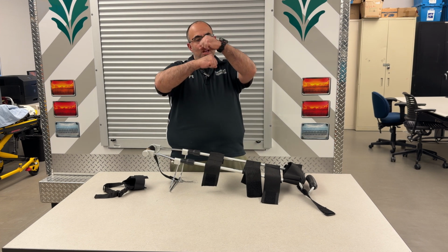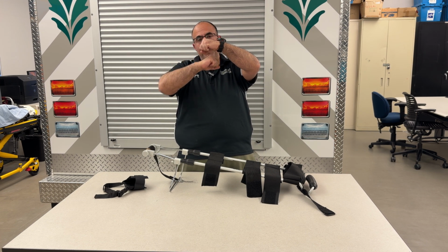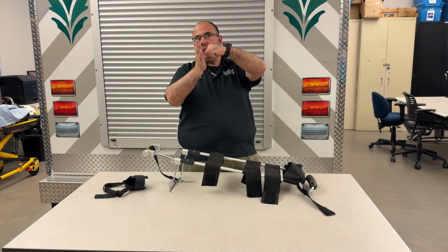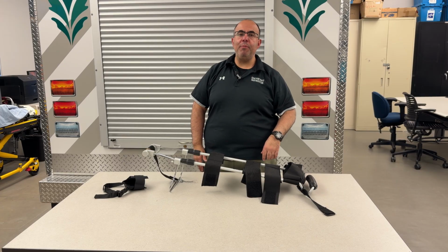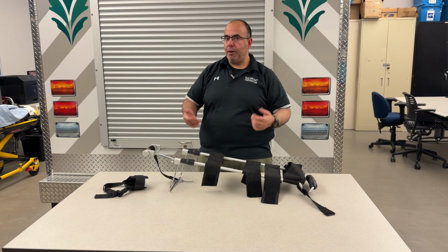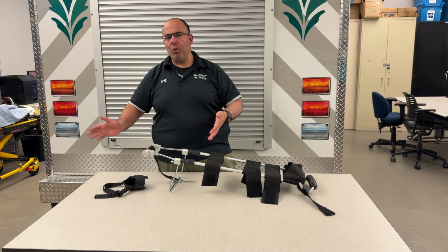Now look at it like this. Your bones for that closed mid-shaft femur fracture are going to be basically on top of each other, and one of the bones might be impinging on that femoral artery. So we have to be mindful of that when we're treating our patients. So that's my indication. It's a closed mid-shaft femur fracture, short and rotated outward.